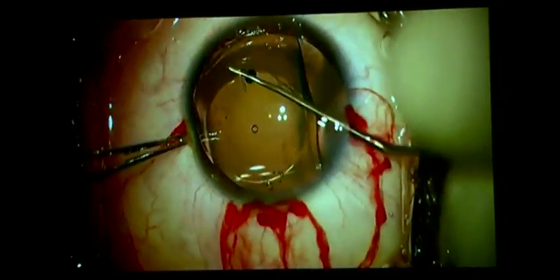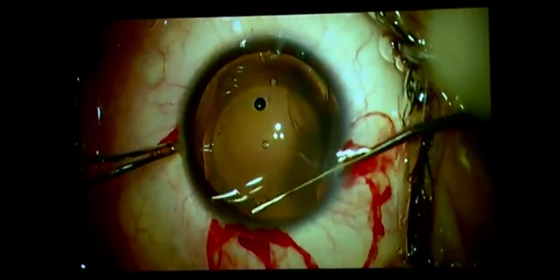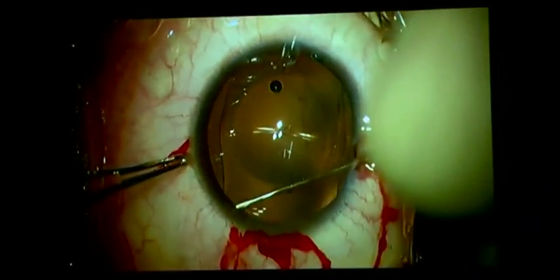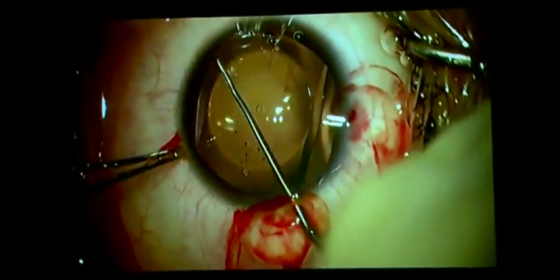So this is a three-way action. Pull it, depress it, rotate it, it goes inside. Then rotate your hand to the proximal area. Again, pull it to the center, depress it and rotate to the left, it will go inside. Similarly here, pull it and rotate, it goes inside. Now all four haptics are inside. You can now tuck it.